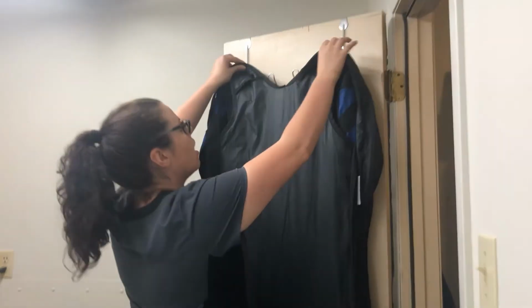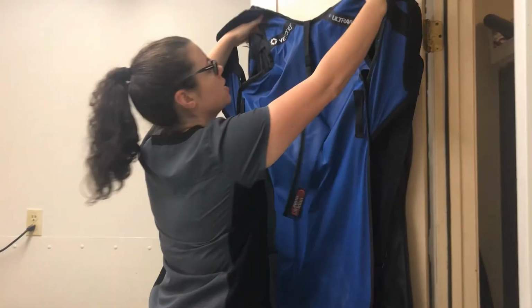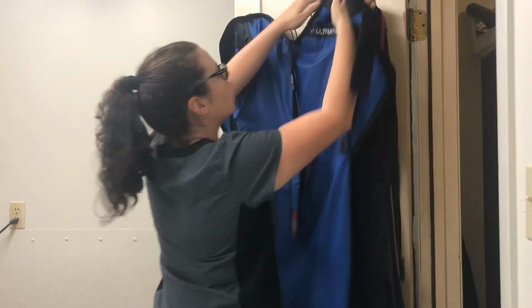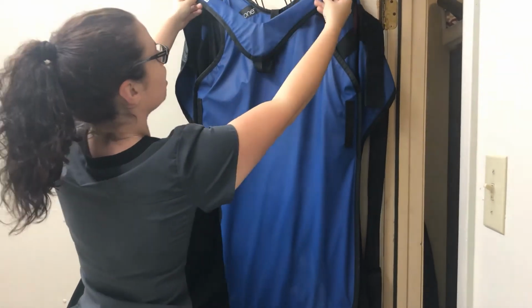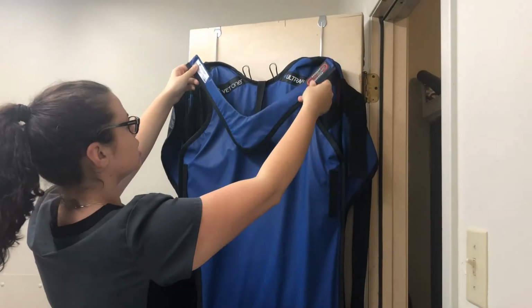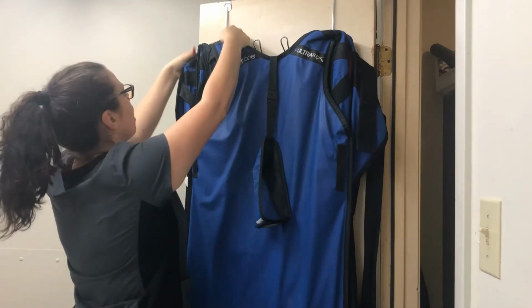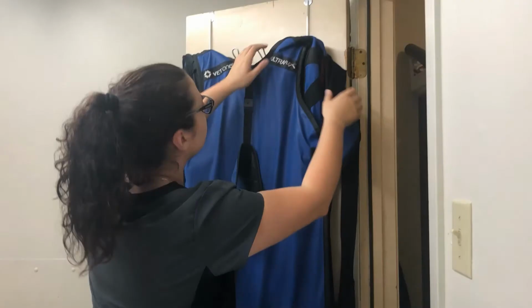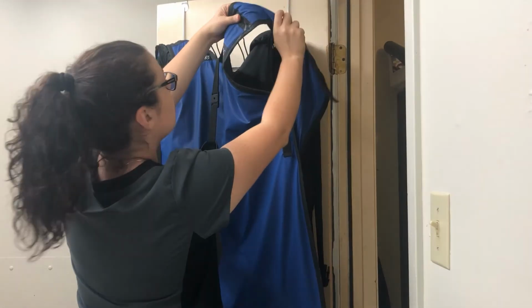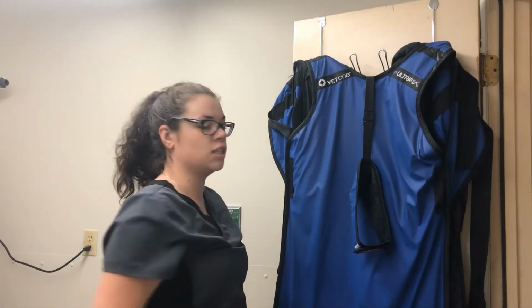We also have our gowns here, and on our gowns our thyroid shields are attached, so by looking at our thyroid shield, we don't see anything here. These are relatively new, so they look it, and we don't have any cracks or anything like that on our apron. And other than some dried slobber up at the top, these also look well enough to use.